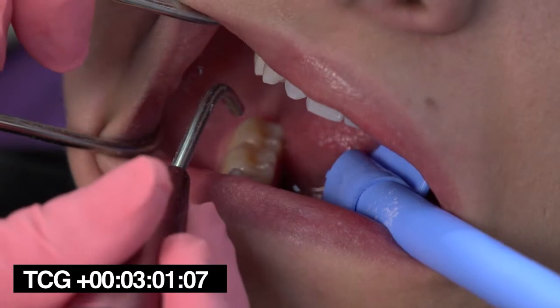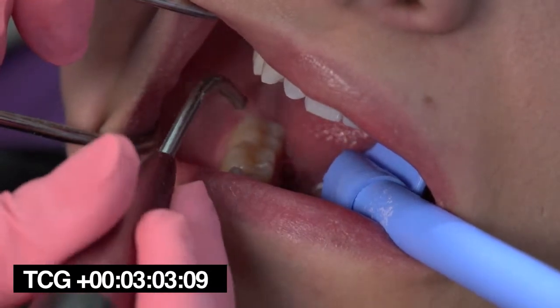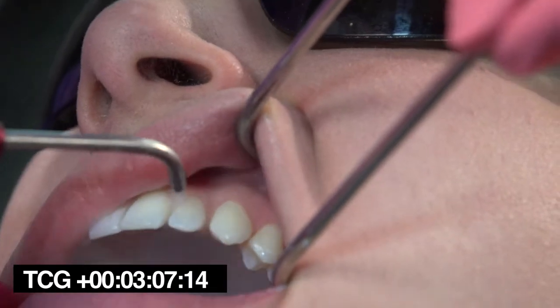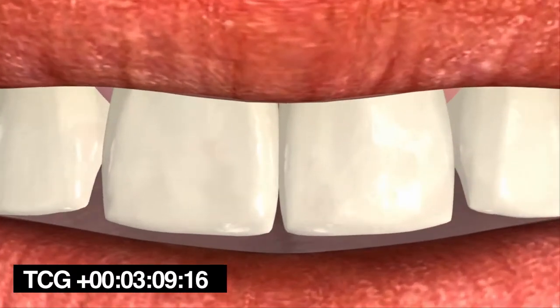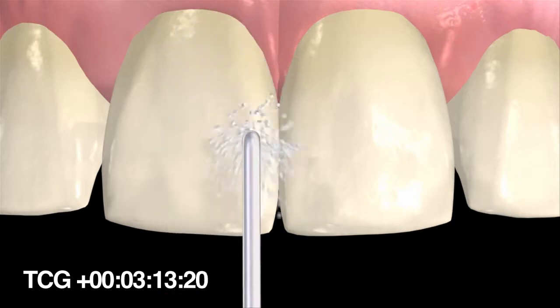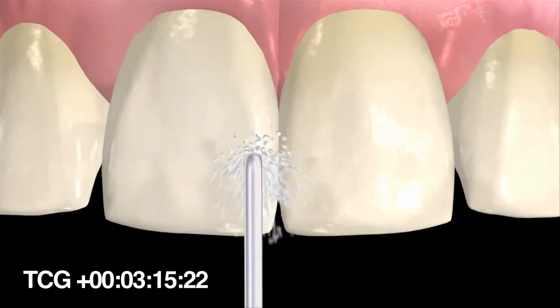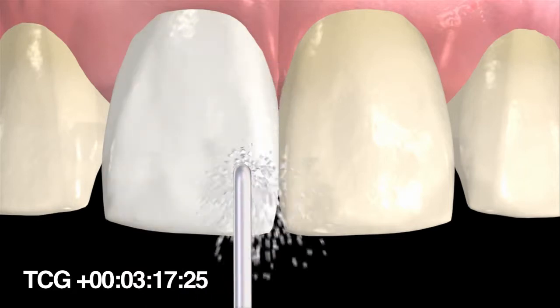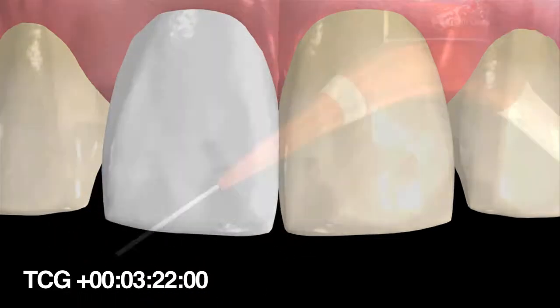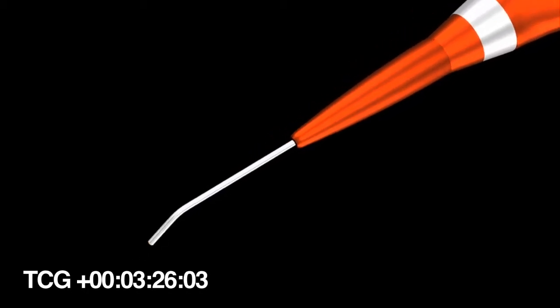Utilizing the appropriate evacuation, apply pressure to the pedal while holding the polisher right side up and rotate the nozzle. Direct the air polisher tip towards the surface of the tooth in small circular motions until the surface is clean of stain and plaque, and avoid directing the stream at any soft tissue. Repeat on each tooth. Nozzle rotates 360 degrees.